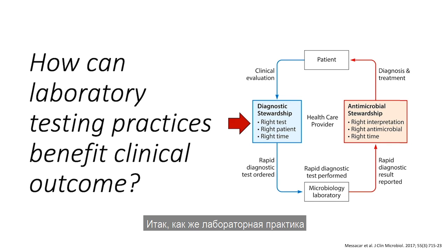So how can lab practice really benefit clinical outcomes? From the lab perspective, diagnostic stewardship is a really hot topic at this point, where you want to offer the right test, to test the right patient, and to do it at the right time. So if you have a really fast test, but you're not doing it at the right time, where maybe you're only offering it once a day or so, are you maximizing diagnostic stewardship in that sense?